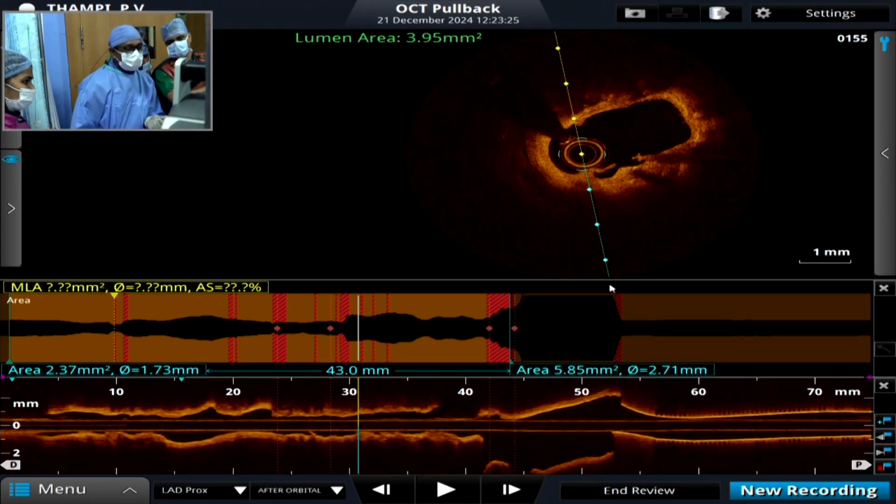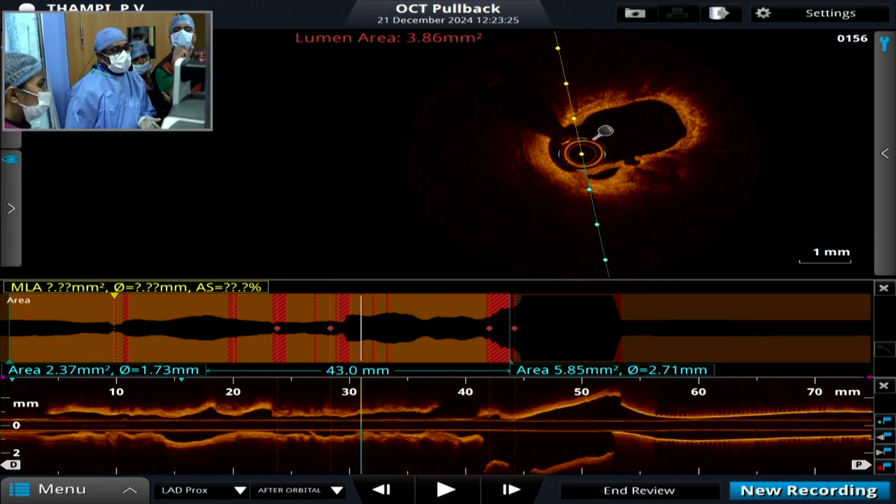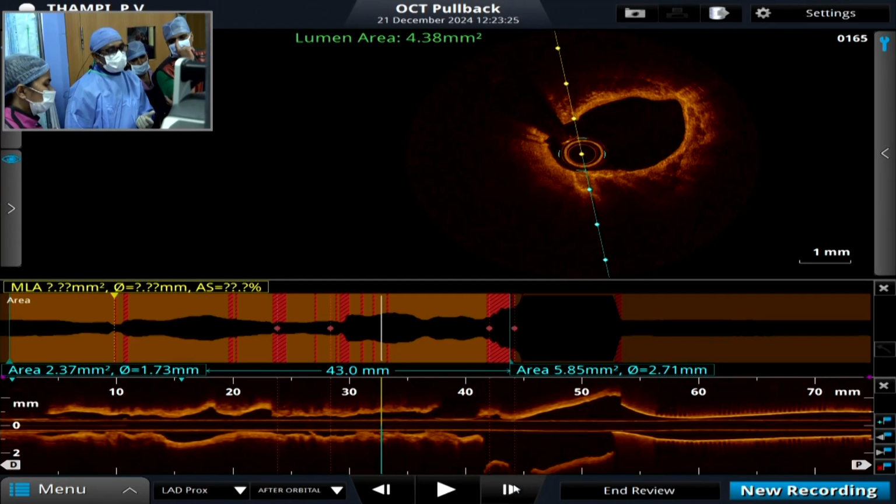See, initially we were discussing cutting a hole in the vessel. Now you could see here that the catheter is actually hugging this vessel wall, and probably it has reached till the media. So this is probably the area where one could have a perforation, because it's away from the imaging catheter, which should be somewhere here. It's very close to the vessel wall. Yeah, eccentric. So that is where probably one could have a perforation.